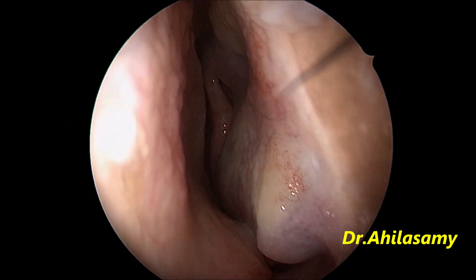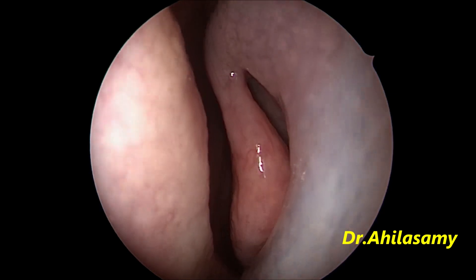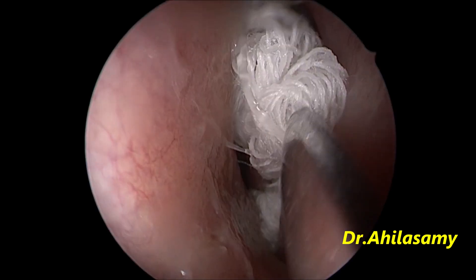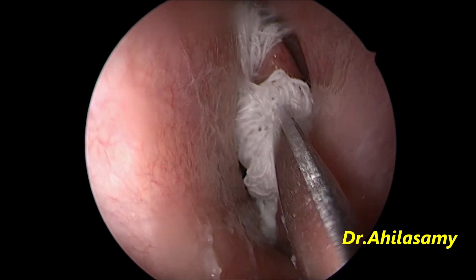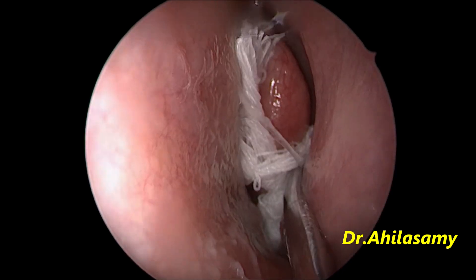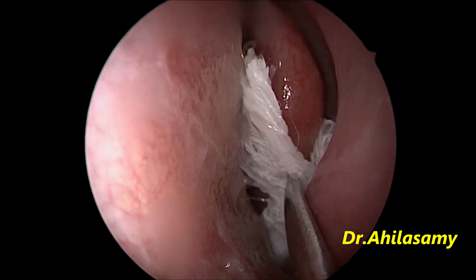This is a gross septal deviation to the right side. You can see the deviated nasal anatomy on the left side is fairly okay. So the first step is to pack the nasal cavity with a solution of 4% lignocaine and adrenaline in the ratio of 1 to 1.